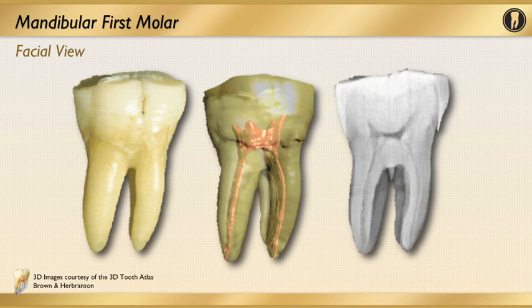And as we notice radiographically, the three-dimensional view of the mandibular first molar, the anatomical considerations of thickness and where these actual canal spaces lie in connection to the actual furcal areas and the actual thin places in the interior or the furcation areas of the tooth are somewhat ominous and need to be considered from a standpoint of too much enlargement, possibly strip perforating a tooth and leading to problems for success down the road.